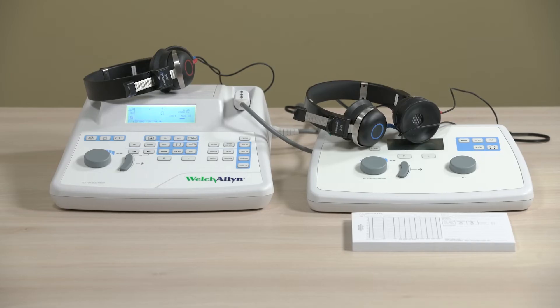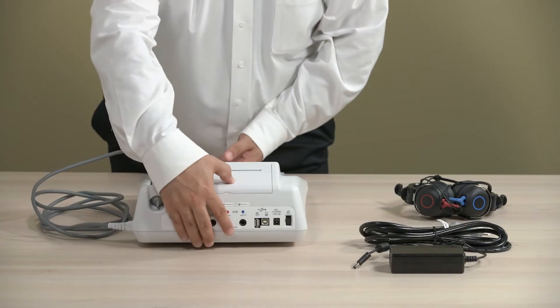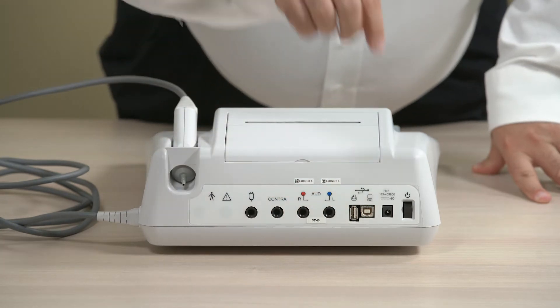Place the devices on a stable counter or table where they will be used in a quiet testing environment. The location should be near a properly grounded wall outlet. Here on the back of the device you'll find the ports for attaching headphones and power supply.